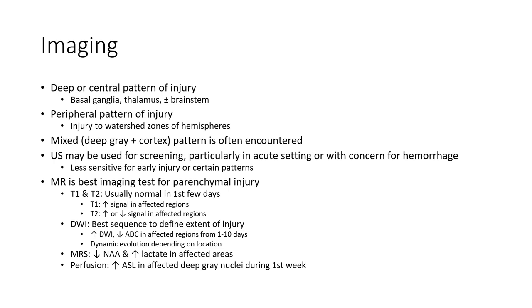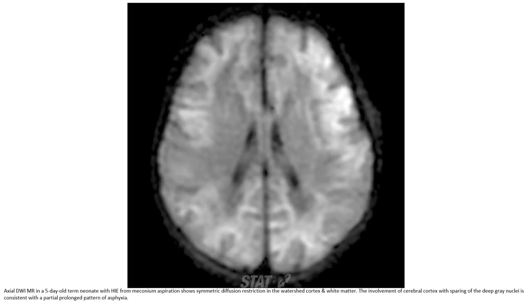Diffusion: increased signal in affected deep gray nucleus during the first week. This is DWI in a five-day-old term neonate with HIE from meconium aspiration, showing symmetric diffusion restriction in the watershed zone and white matter.